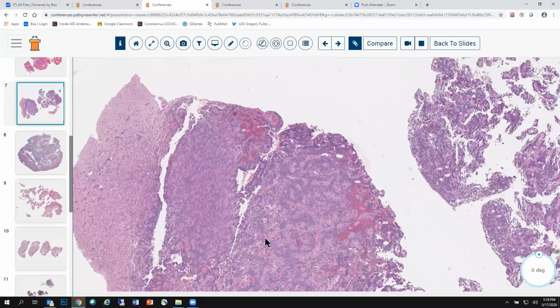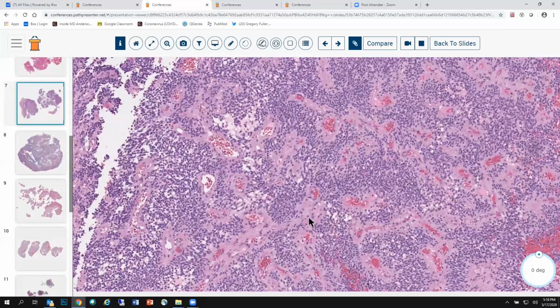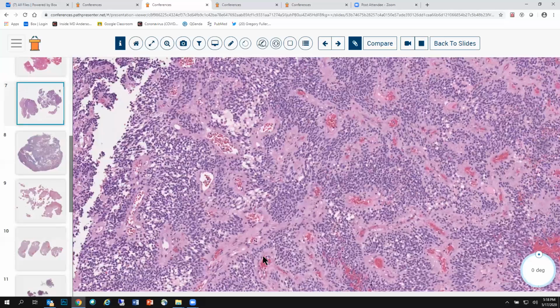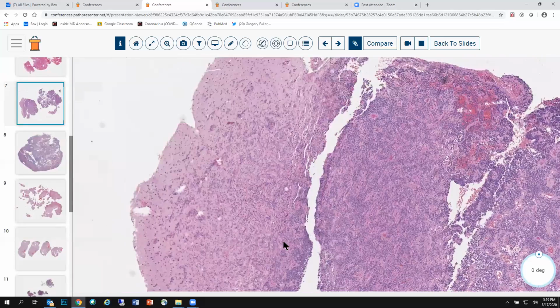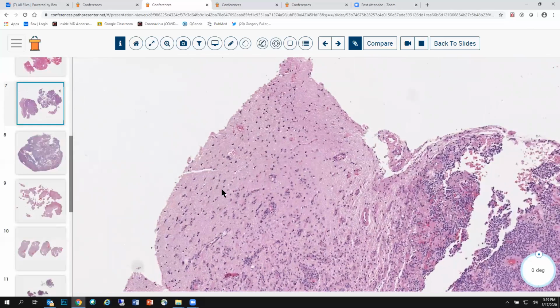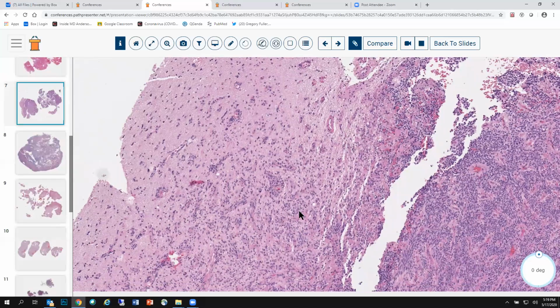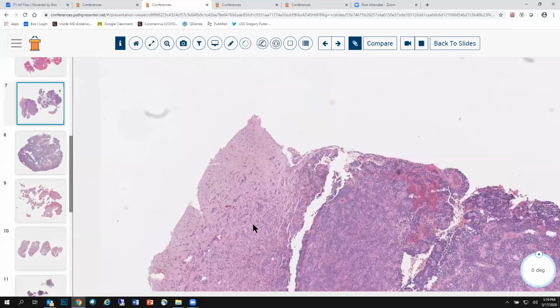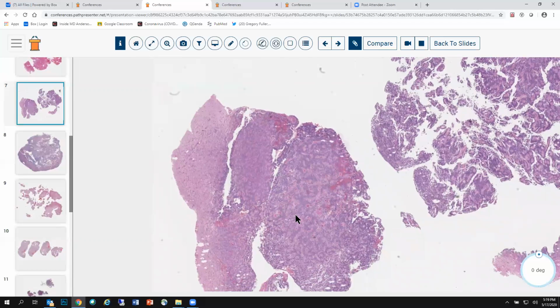Notice that it's solid. One of the first things that you should do when you're examining a slide that is a solid tumor in the brain, try to find an area of normal brain and look at the interface. And we have an area like that right here. So here's brain, and you can see this is totally uninfiltrated normal brain at the periphery. And then we have this very, very tight, short zone of infiltration. That's great for the border of ependymoma. Relatively circumscribed tumors, treatment is gross total resection. All right, let's move on.